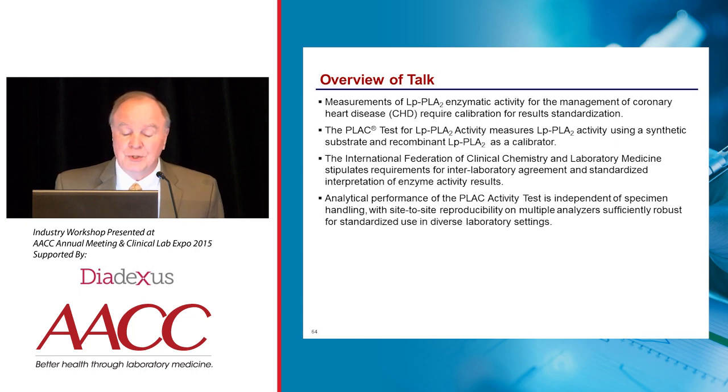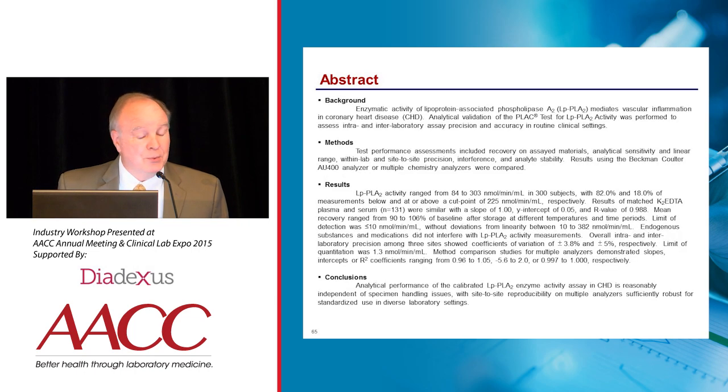And you've heard from the previous two speakers that the test has great clinical utility. What I'm going to focus on is the fact that we can harmonize, or at least start the process of harmonization. So irrespective of where the test is done, any clinical laboratory in your city perhaps, you'll get essentially the same results. And that'll really help the clinicians that are seeing patients in different hospitals in a community like mine in Oklahoma City.